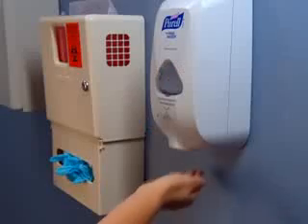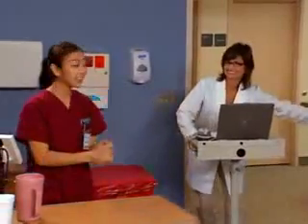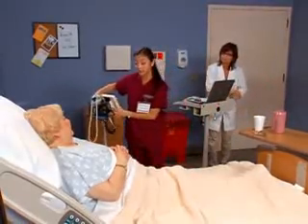Hi, Mrs. Hodge. I'm Rose. I'm a student nurse, and I'm going to take care of you today. This is Miss Varga. She's my nursing instructor. How are you doing today? Fine. I'm here to measure your vital signs, if that's okay with you.